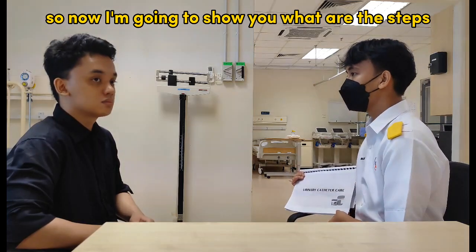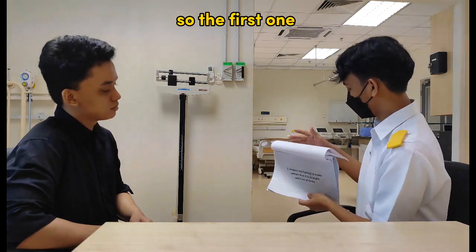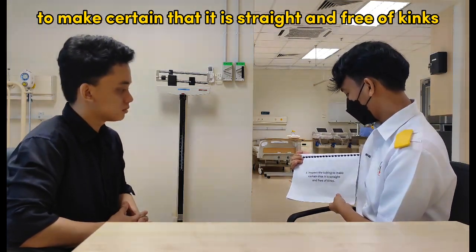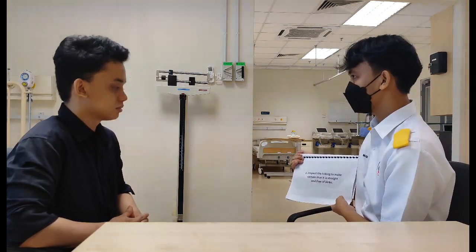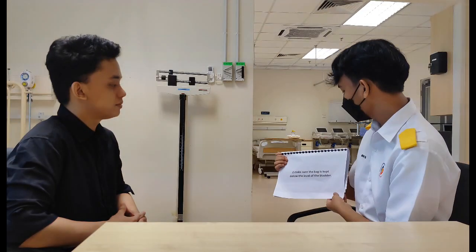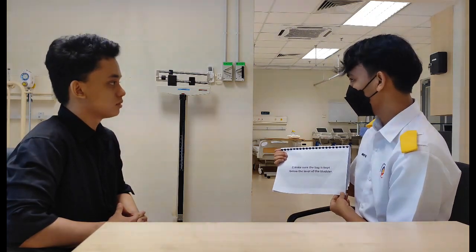Now I'm going to show you the steps that you're going to do for your father at home. So the first one is to inspect the tubing to make certain that it is straight and free of kinks. The reason behind this is basically to make sure that the urinary catheter is working and there is flow of urine. Number two is to make sure the bag is kept below the level of the bladder. This is to make sure that the urine will flow following the direction of gravity.